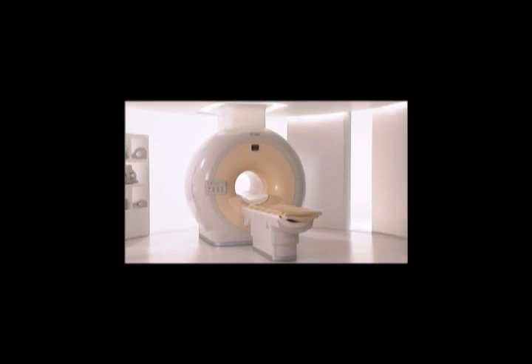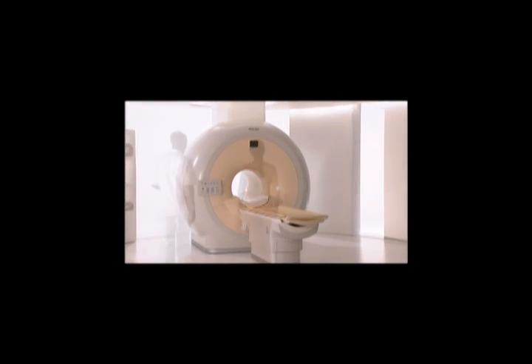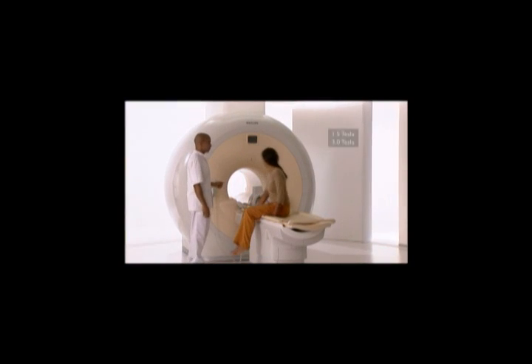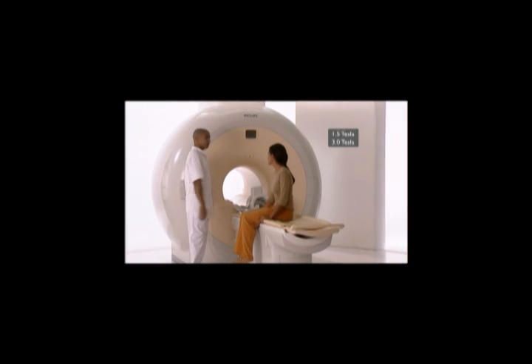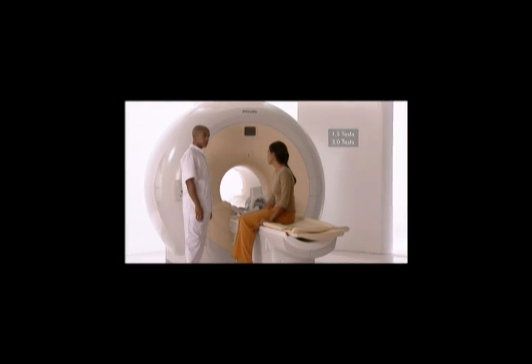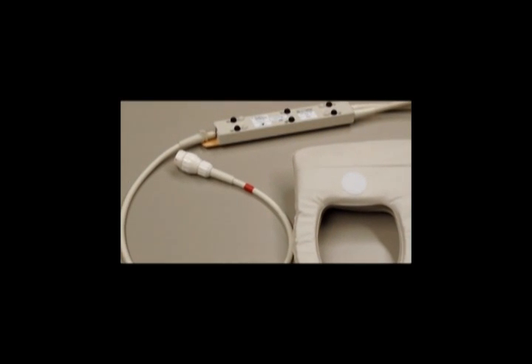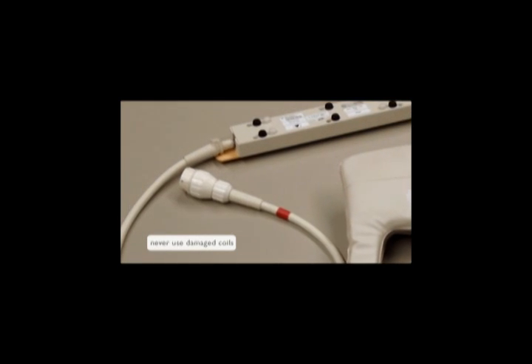Conditions. The likelihood of an incident increases with the RF energy level. Since high-field systems operate at higher RF energy levels, particular attention must be paid when using high-field systems. Over the course of time, RF coils are subject to wear and tear. Never use damaged RF coils.